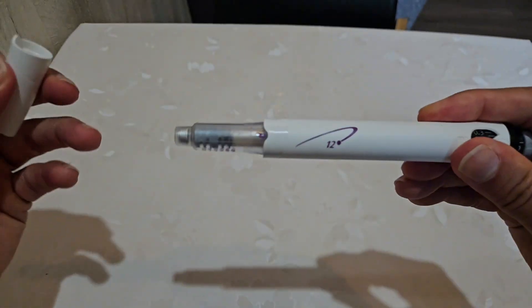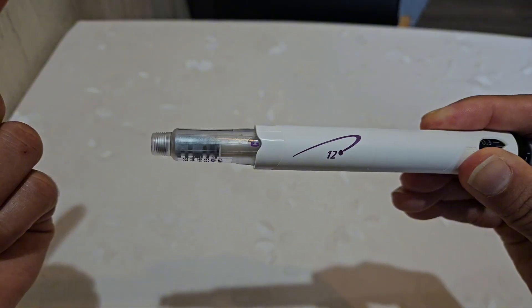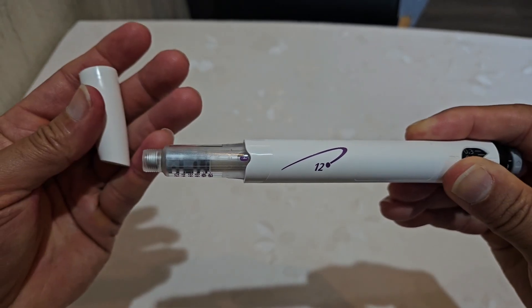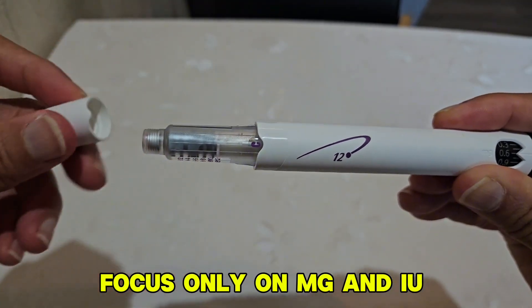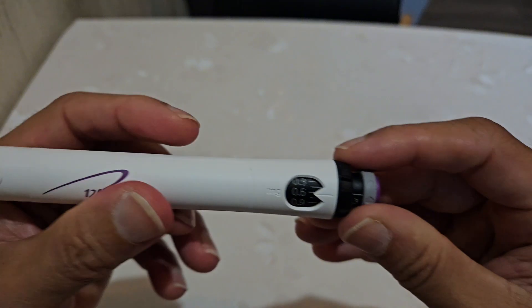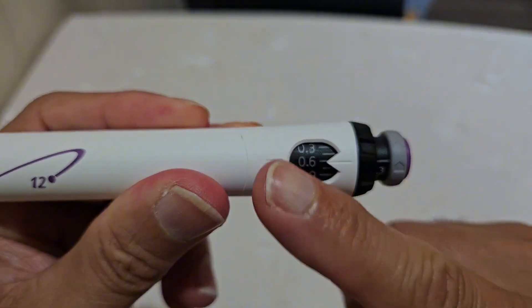One milliliter is whatever liquid was inside the pen — it's usually not exactly one milliliter, but it doesn't really matter. What you should focus on is milligrams and the number of international units you deliver per day. Let's go to the dial now — here you can see 'mg' on the dial.